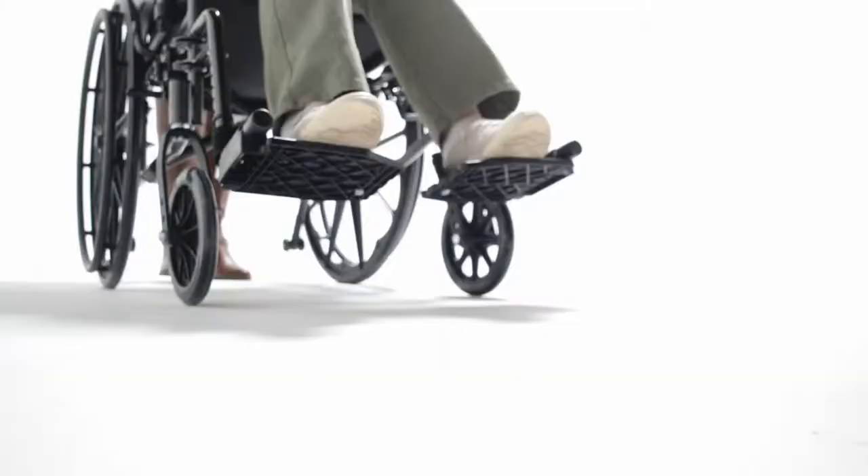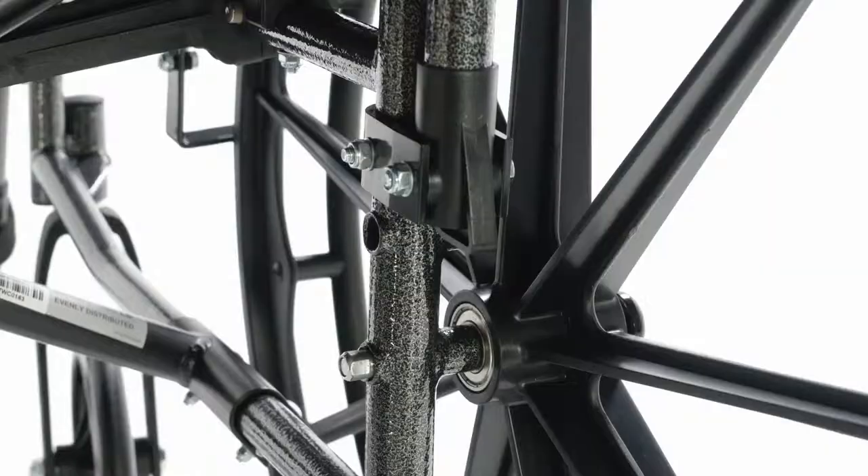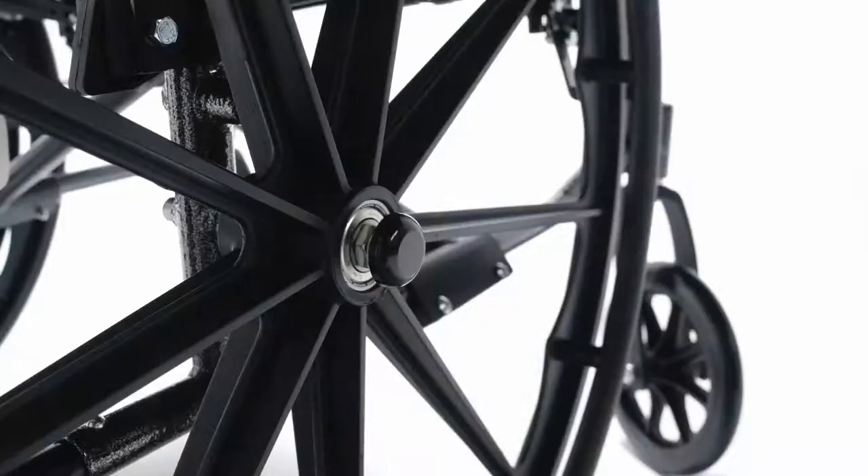Place your favorite things on the standard back chart pocket. The Traveler L4 comes with non-marking polyurethane rear tires to facilitate movement. It features a two-position axle and multi-position caster fork to provide a two-inch seat height adjustment.